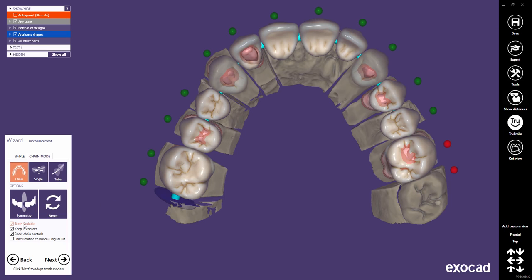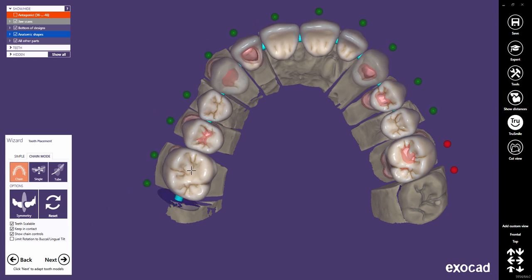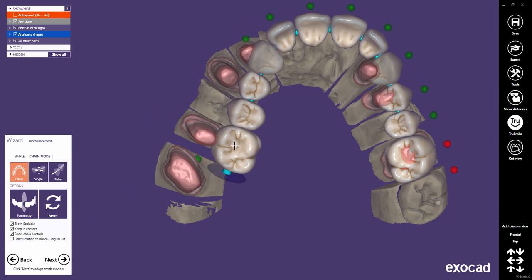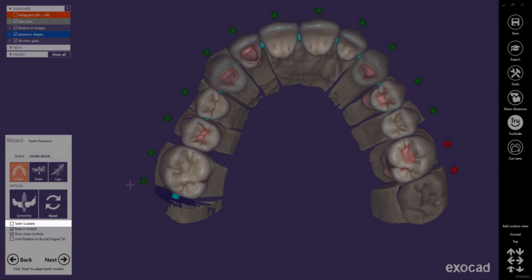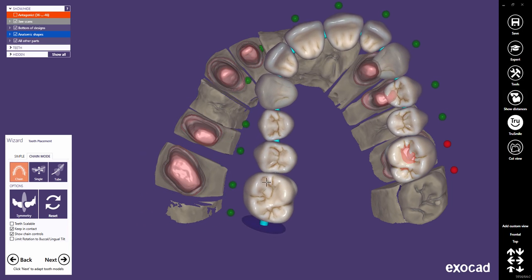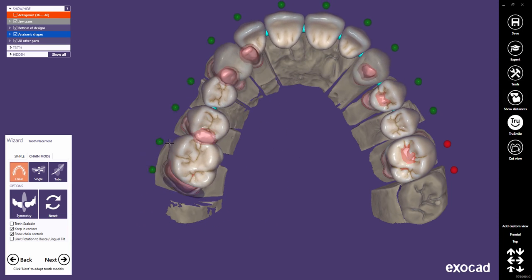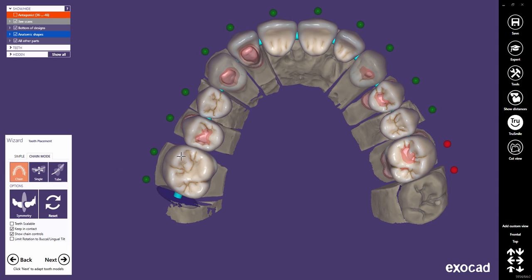You may have noticed that the teeth will be scaled if you do a big transformation on the chain. This behavior can be switched off, with the result that you cannot stretch the complete tooth bow wider than the total width of all teeth together, as the teeth keep their size.